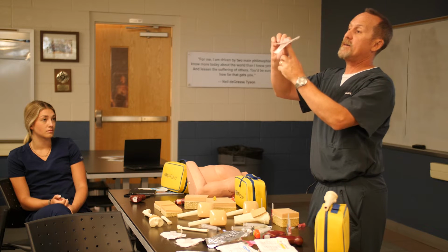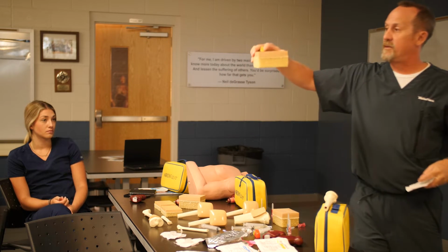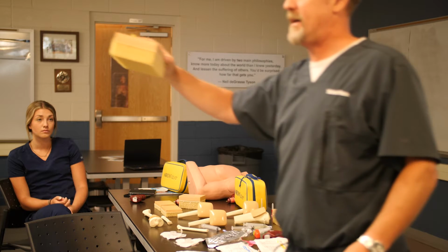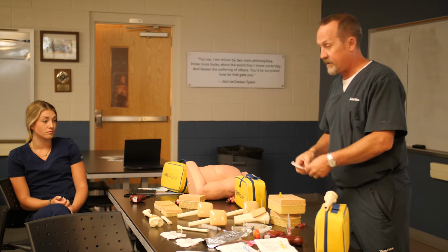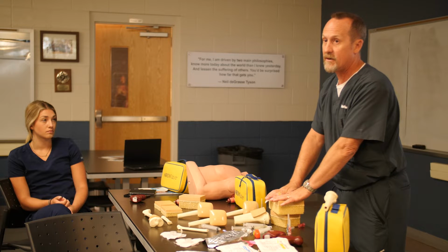The other thing that I wanna point out is it actually has kind of a little telescoping mechanism in it, okay? Notice when I put this needle into the patient, I get through that cortex, I didn't put that hub all the way down to the skin. We're not trying to get the hub to the skin, we're trying to get the needle and the catheter through the cortex into the medullary space. So if that hub is sitting high, it doesn't matter, that's why that dressing is designed to telescope like that. So we can actually take the dressing, we're gonna put it over the hub and push it down to the skin. Now you can remove your 1 and your 2 and stick down that Tegaderm.